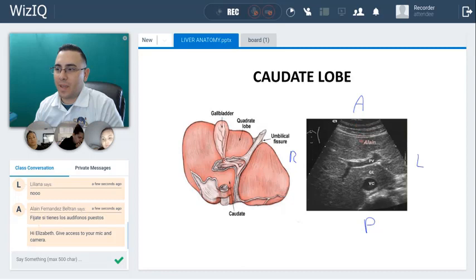The caudate lobe is a very posterior location. It is anterior to — in fact, it's anterior to the inferior vena cava — and it's posterior to this structure here that we call the ligamentum venosum. It's in between; this is the caudate lobe right here.